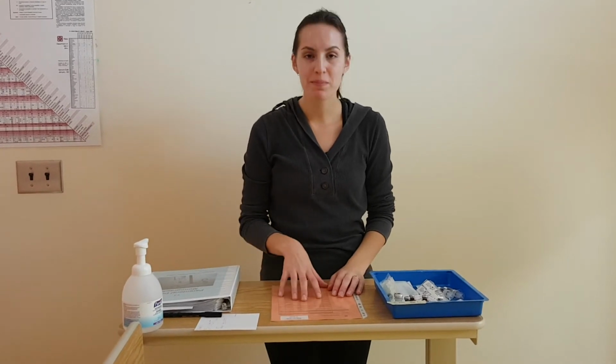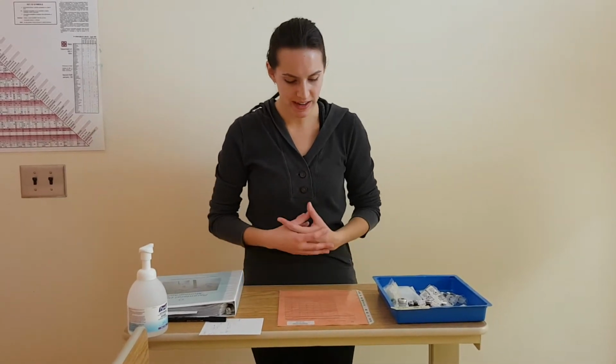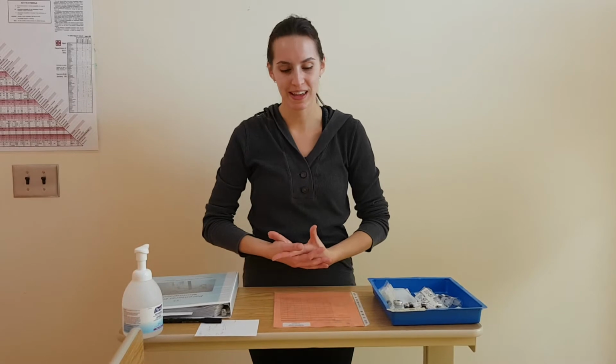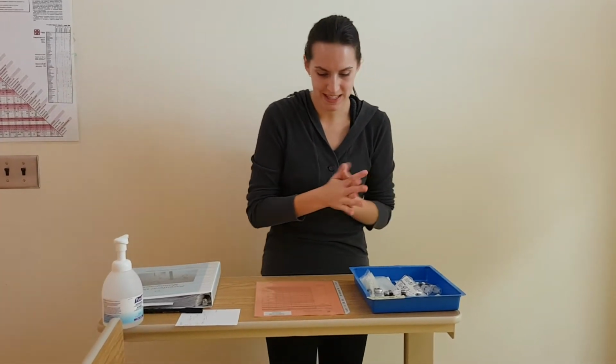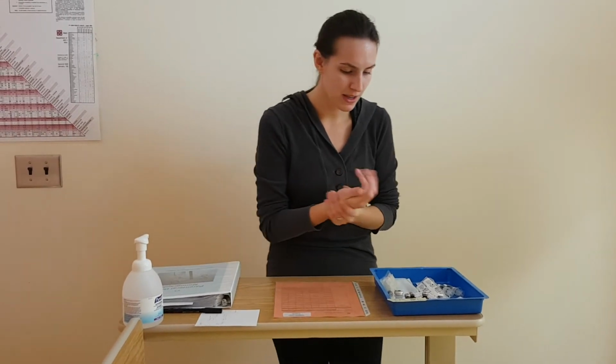Today I'm going to demonstrate how to administer medication via CIVA. So I've compared my MAR to my doctor's order and ensured that everything was transcribed accurately. I then brought my MAR to the Pyxis machine and I got my correct medication as well as gathered all my supplies.